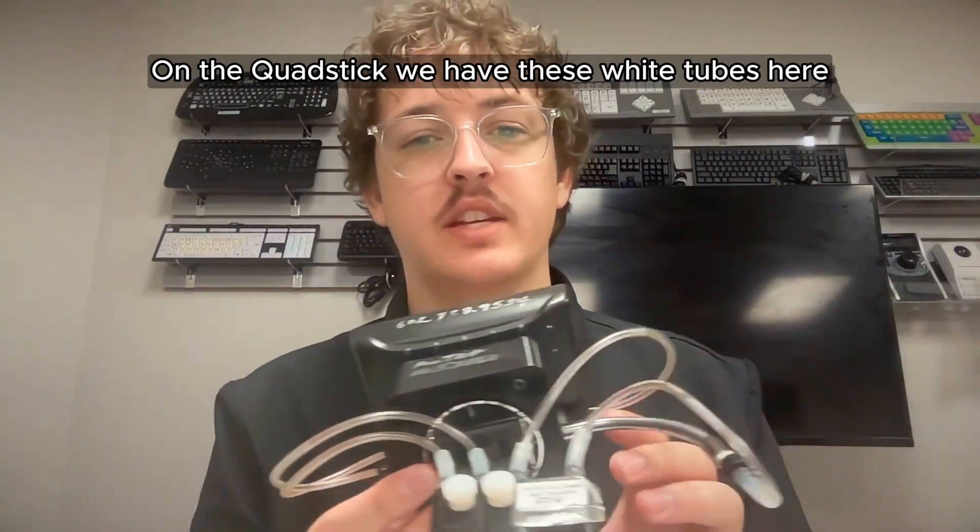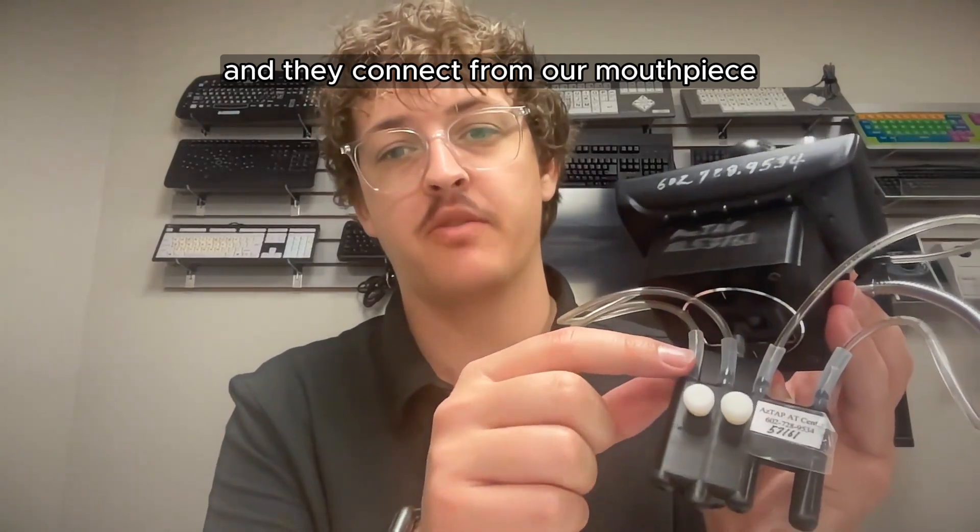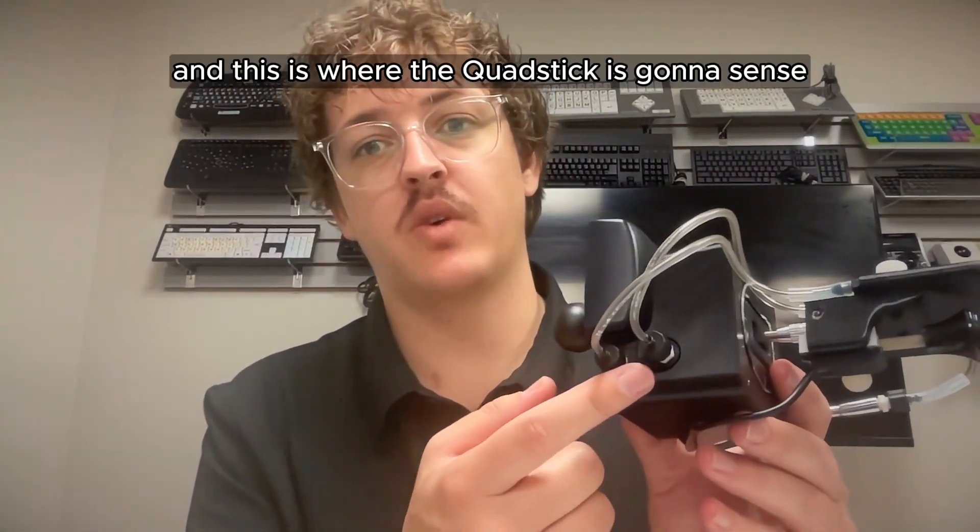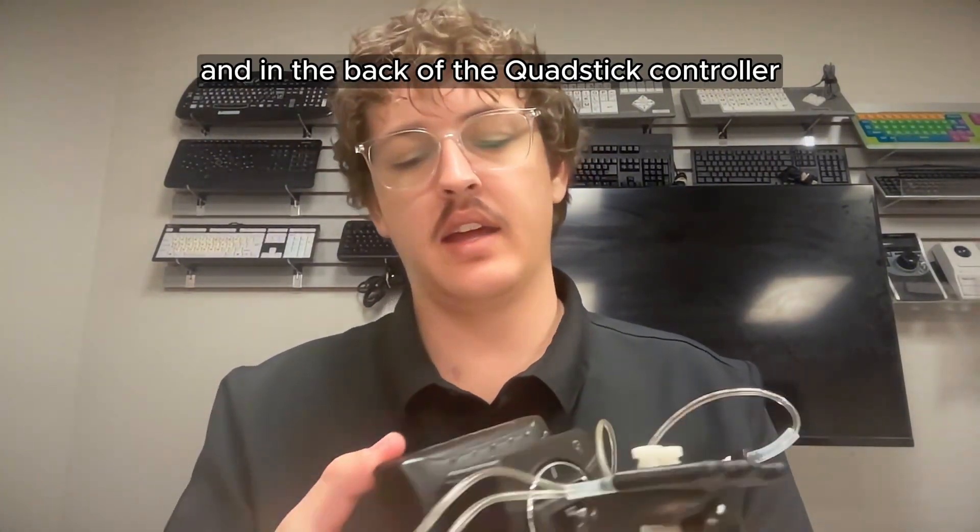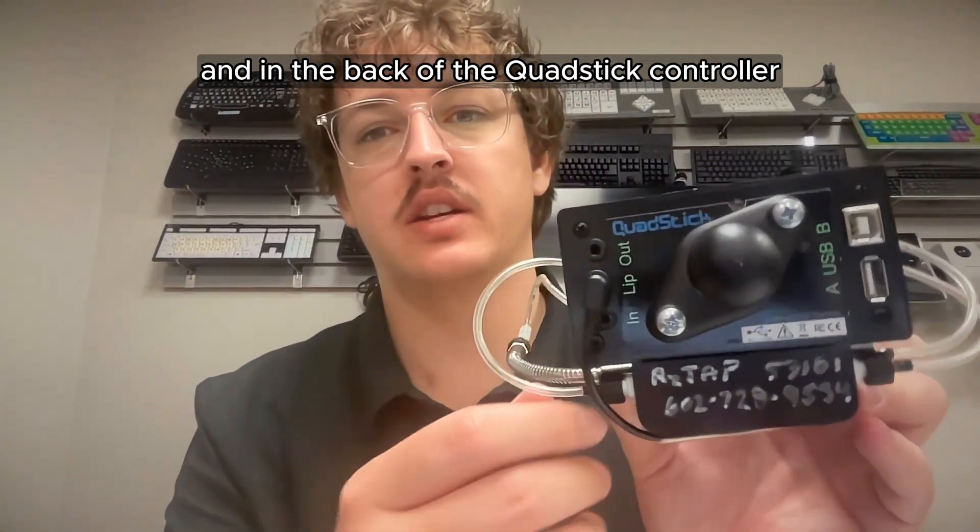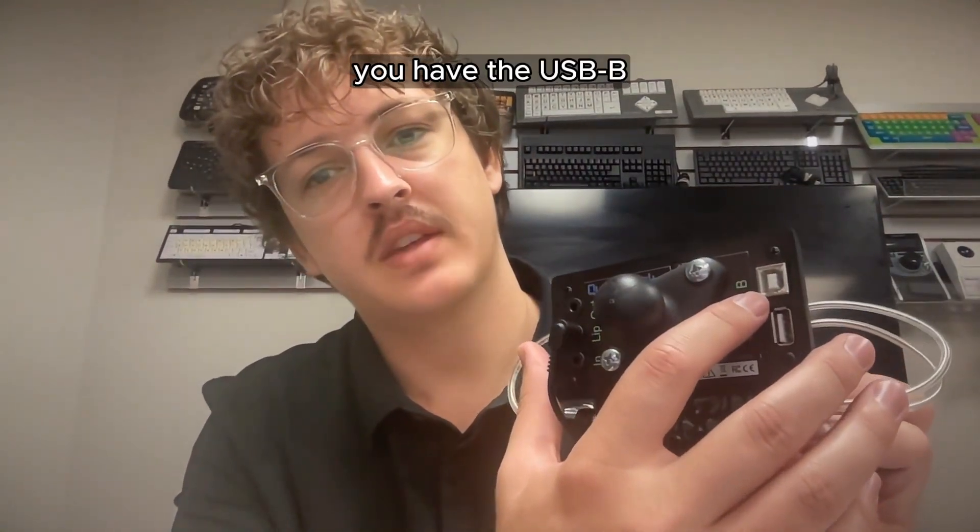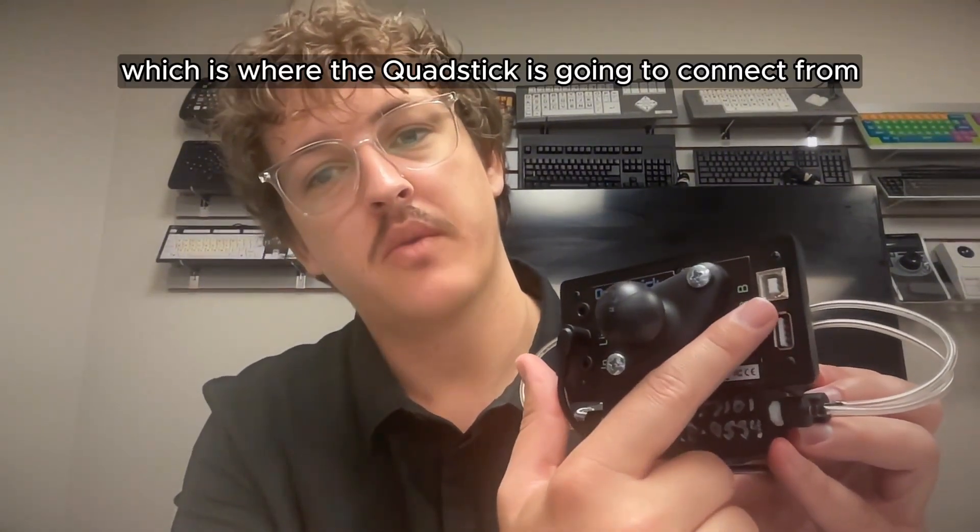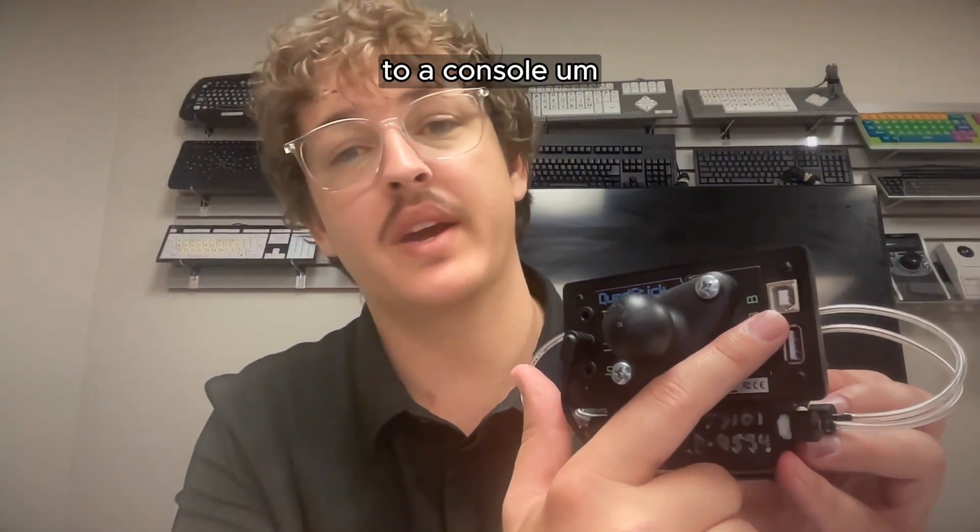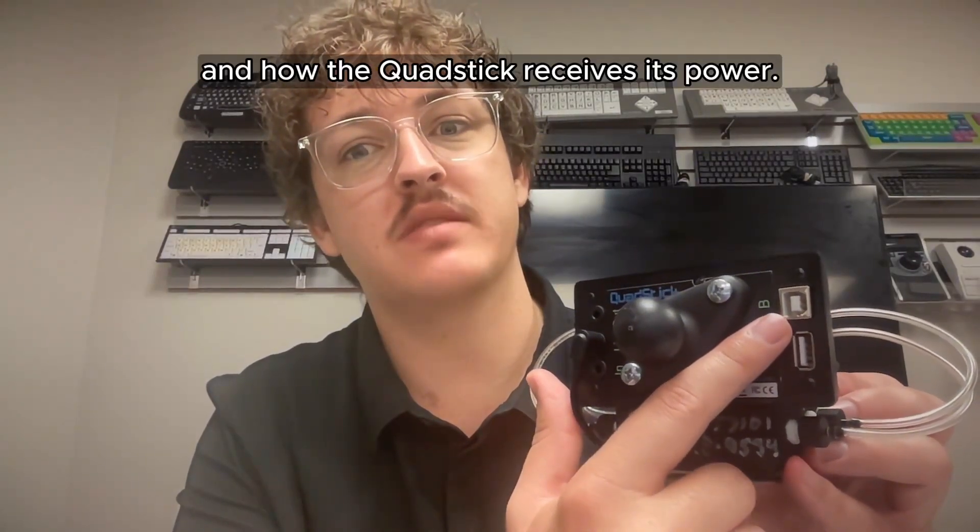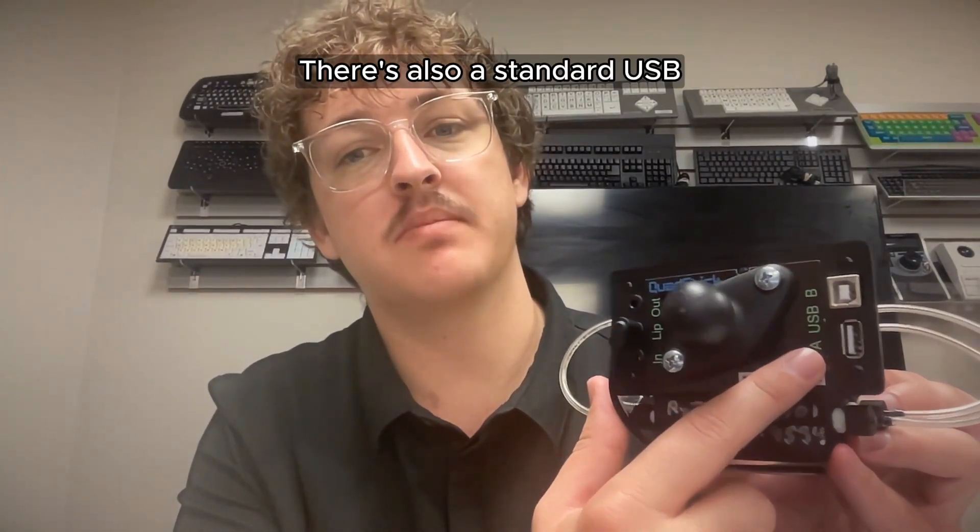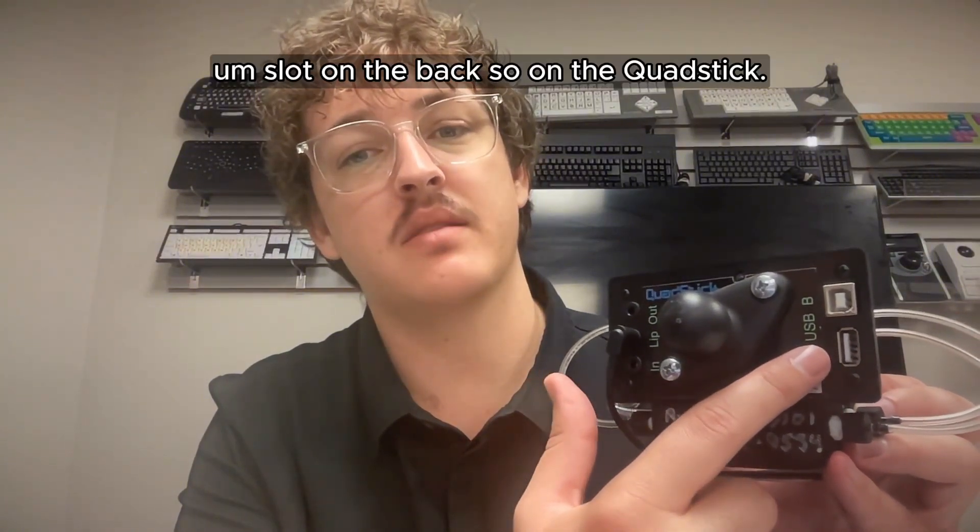On the QuadStick, we have these white tubes here, and they connect from our mouthpiece to the controller. And this is where the QuadStick is going to sense whether it's a sip or a puff that had happened. And in the back of the QuadStick controller, you have the USB B, which is where the QuadStick is going to connect from to a console and how the QuadStick receives its power. There's also a standard USB slot in the back.